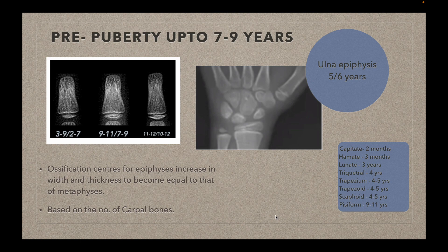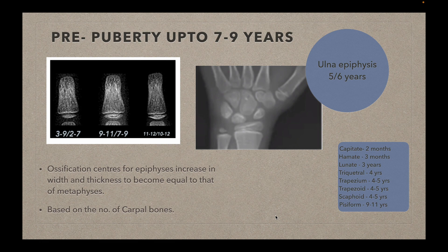The next stage is the pre-pubertal stage, up to seven to nine years. During this stage, the epiphysis continues to grow. The picture shows three different phases: first, the epiphysis is shorter in width compared to the metaphysis; second, it grows to become almost equal in width to the metaphysis; and third, both are equal in width. Following this, capping takes place where spurs appear on both sides as the epiphysis grows and covers the metaphysis. The number of carpal bones visible on x-ray roughly corresponds to the child's age in years. Also, the epiphysis of the ulna appears at five years in females and six years in males.